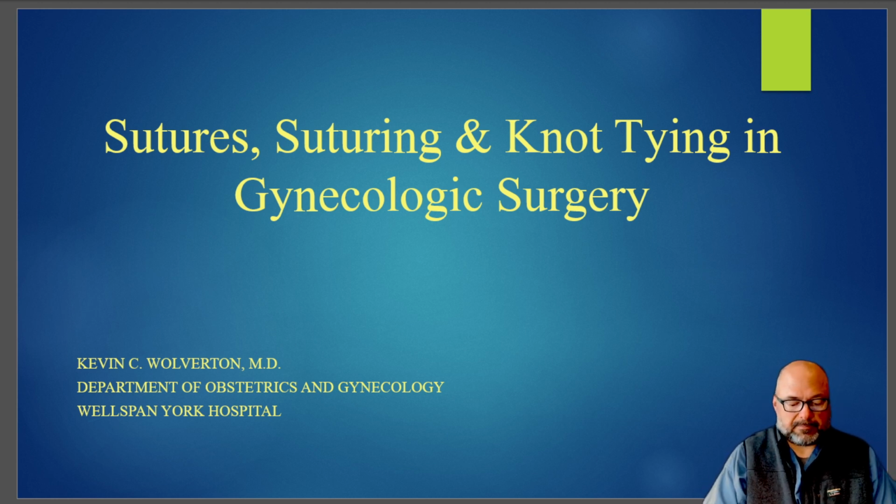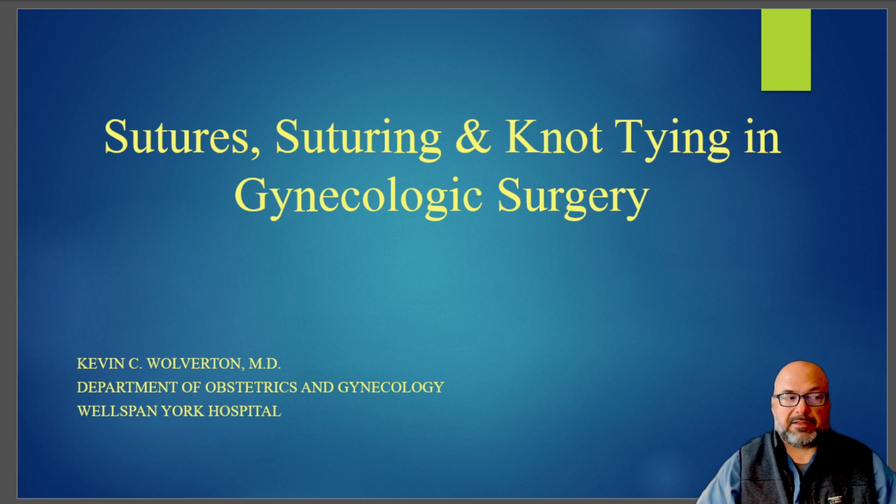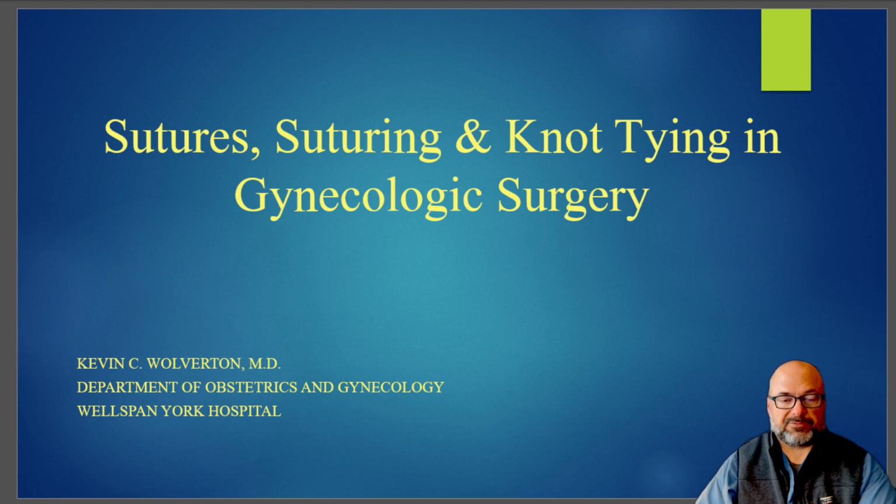So in the video part of today, we're going to go through the PowerPoint presentation that I've got, as well as some videos that I made of different knot tying, kind of knot tying 101, and then basics of suturing technique. And this is stuff that we'll be working on in the hands-on skill sessions as well.